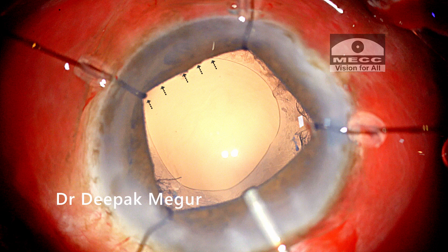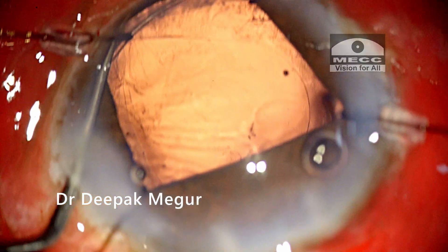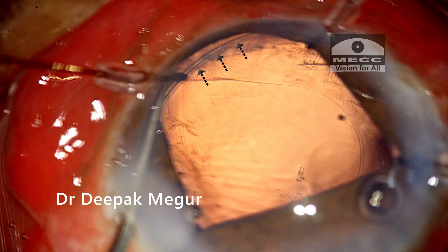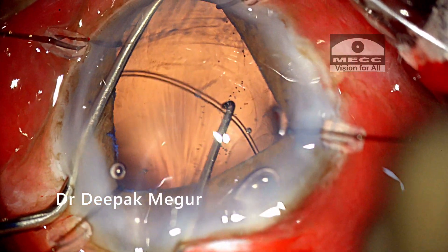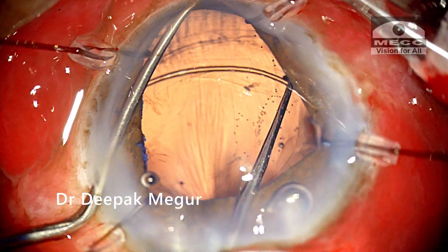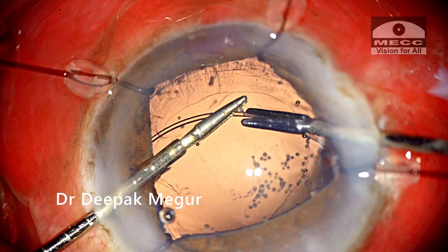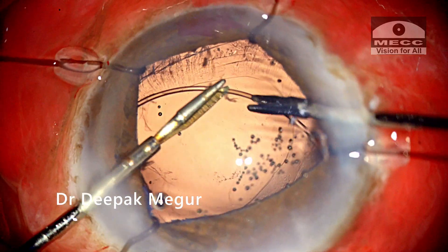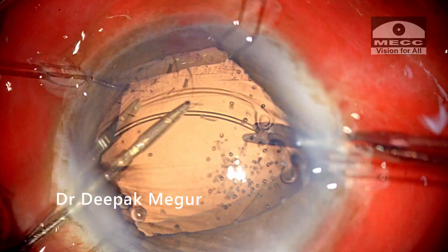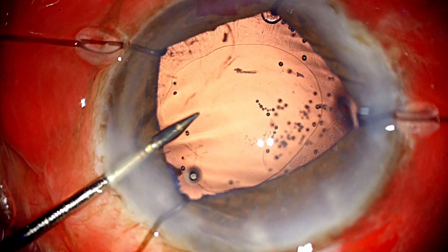So what did I learn from this case? An eccentric rhexis can indicate a misplaced CTR, so whenever we encounter this situation it is mandatory to retract the iris in that quadrant to find the cause. To manage these tricky situations, I found that using a bimanual technique with two micro forceps was the best way to reinsert the CTR into the bag. Hence it is worthwhile to keep these instruments handy. Thank you for your attention and I hope this helps.